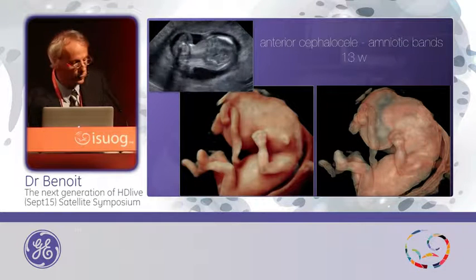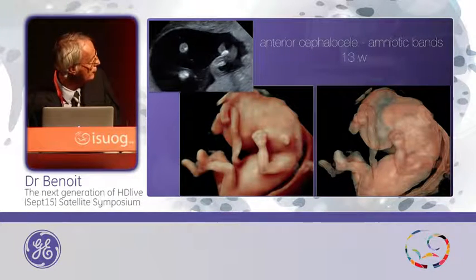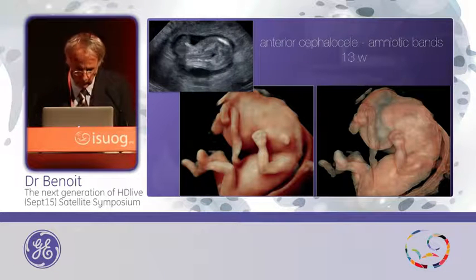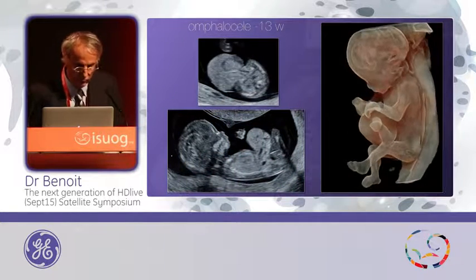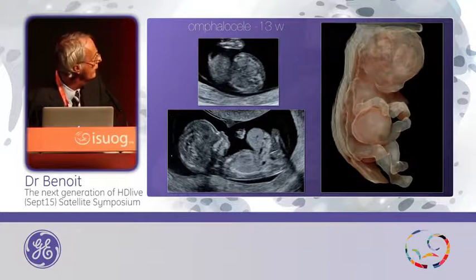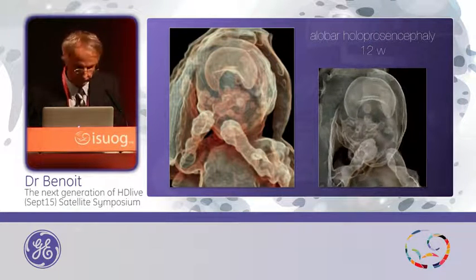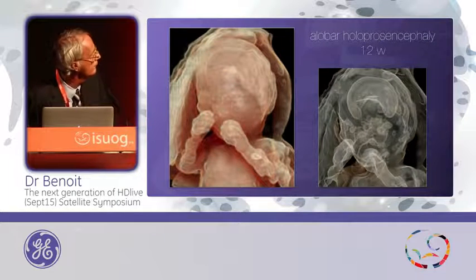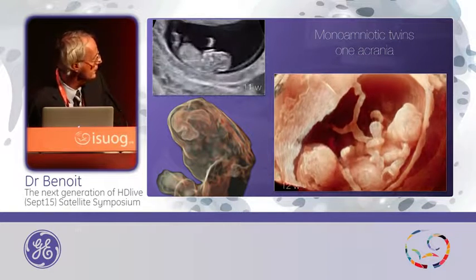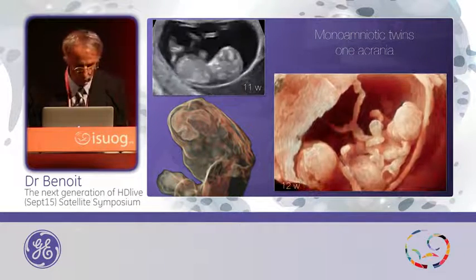Malformation: this was an anterior cephalocele caused by amniotic band — the cord was stuck on the head to the cephalocele, and with transparency you can see the liquid part and a part of the choroid plexus was outside. Omphalocele at 13 weeks of pregnancy with club hand. Holoprosencephaly at 12 weeks — you can demonstrate this single frontal ventricle without cutting with a magic cut. This was monoamniotic twins where one had acrania — the 2D picture was at 11 weeks and the 3D picture at 12 weeks with a tangled umbilical cord, and with silhouette you can see the abnormal shape of the ventricle inside the brain.